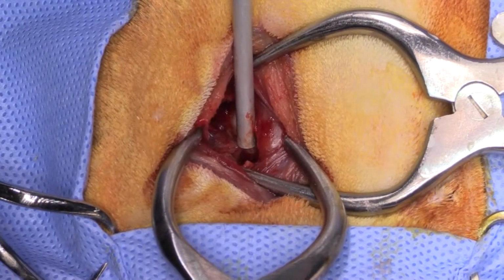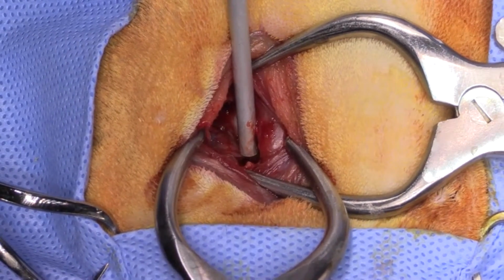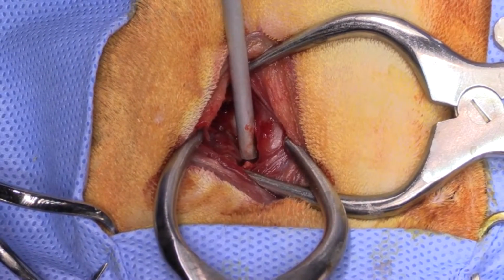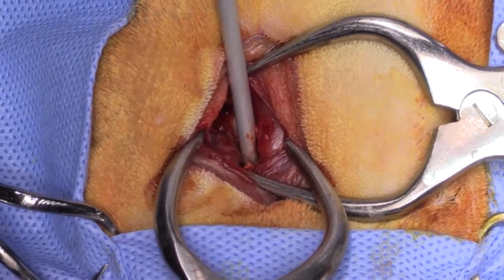All right, so that is, where's my curette, please? Curette, sorry, the little guy. It's a tiny one. It looks like that. I've been a messy surgeon and thrown something on the back table.